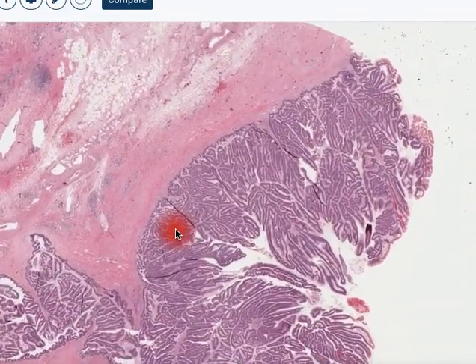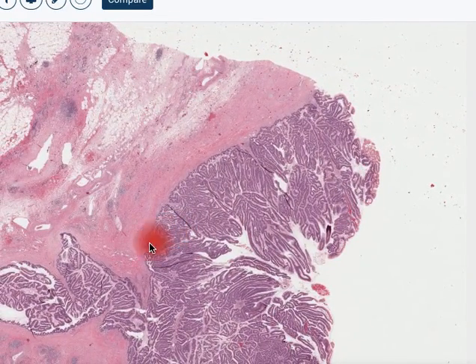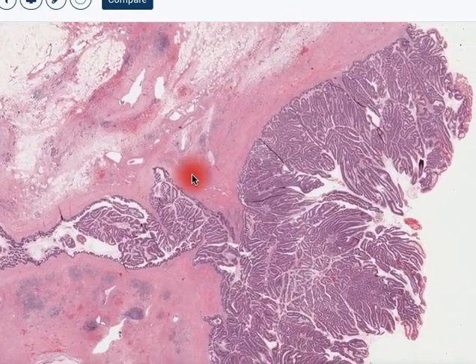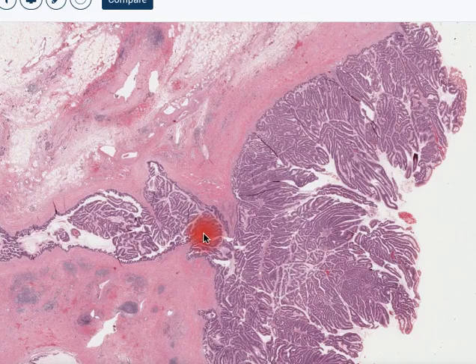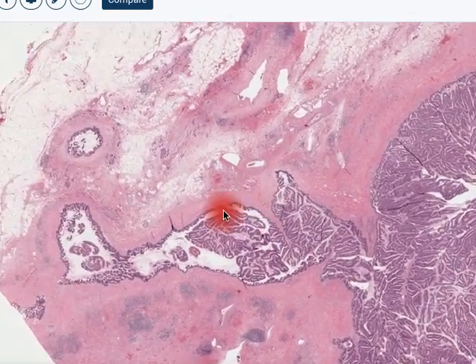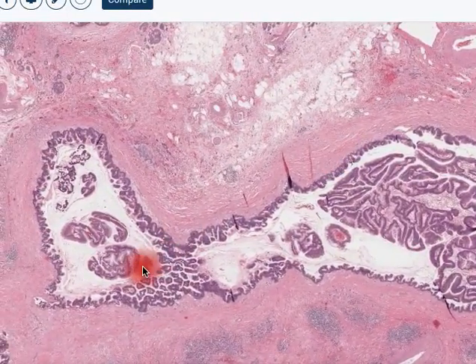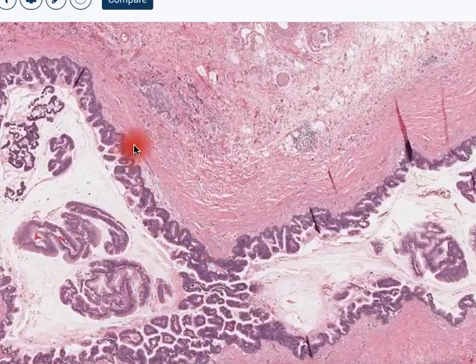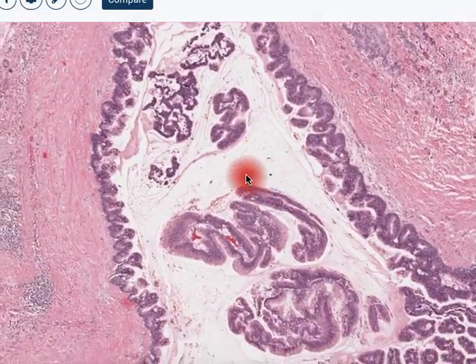We would consider this to be an intraductal papillary mucinous neoplasm with areas of dysplasia. Now that is established, we have to ask the question: is there evidence of invasion? So we'll look further along this margin to see whether there is evidence that this is other than an intraductal process.